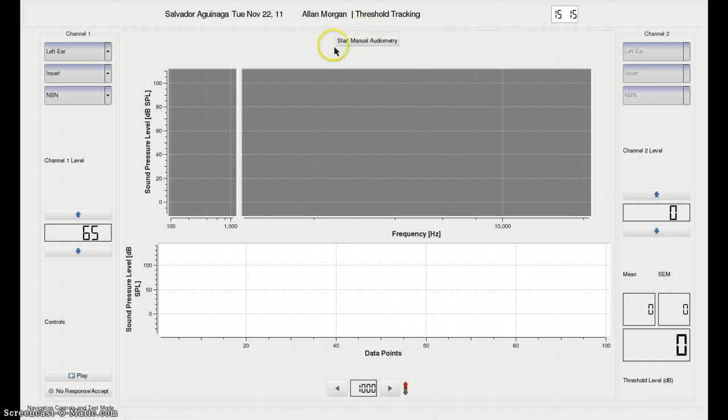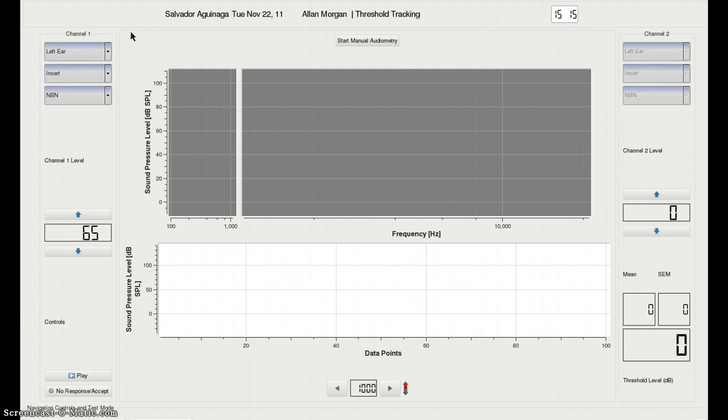Eventually we're going to add manual audiometry to this window, but currently we do not have that functionality turned on. As you can see, most of the controls are essentially the same, although the GUI is laid out differently.